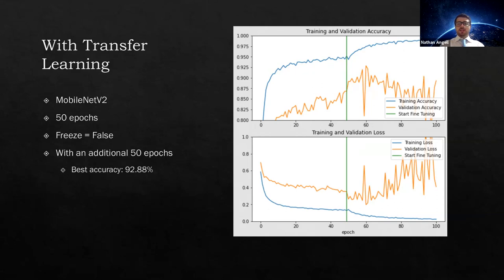By setting it to false, it essentially allows us to edit more of the transfer learning model's parameters to better fit our dataset. Another way of putting it, we essentially allowed the model to edit only 1,281 of the 2.2 million parameters. This will make sure that when the model looks at our data, it can better detect pneumonia. So as a result, with an additional 50 epochs, we got our best accuracy of 92.88% at an epoch of 60.